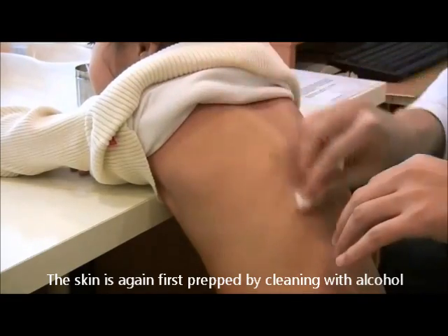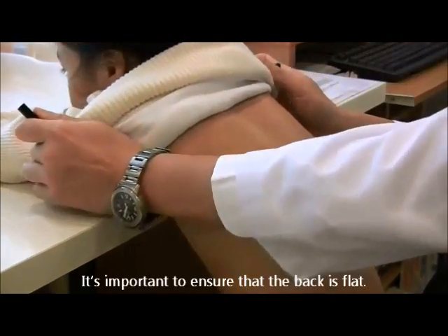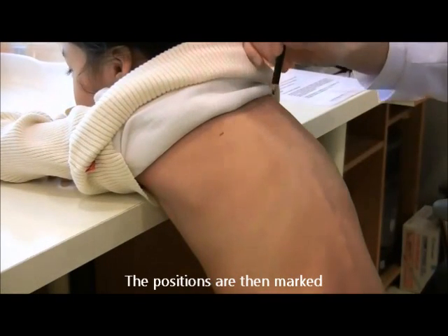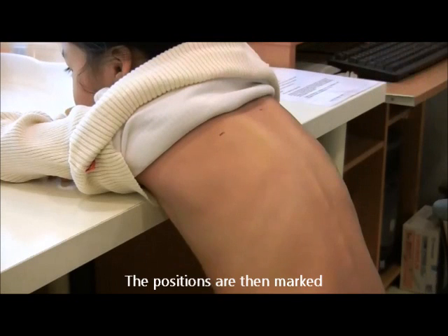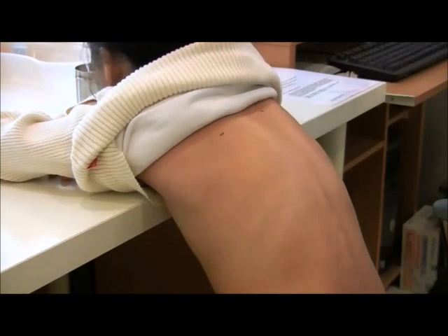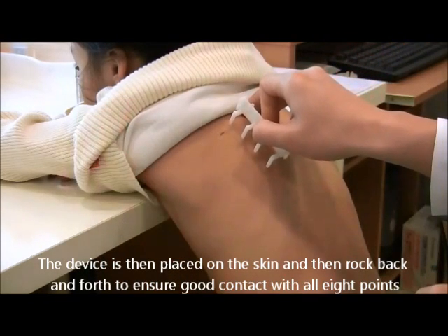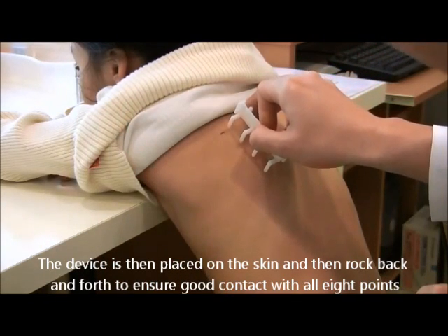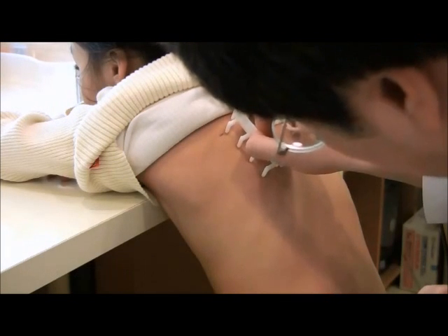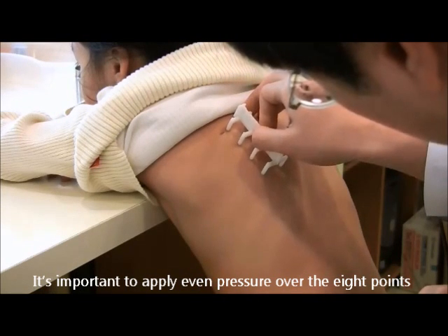The skin is again first prepped by cleaning with alcohol. It is important to ensure that the back is flat. The positions are then marked. The device is placed on the skin and rocked back and forth to ensure good contact with all eight points.